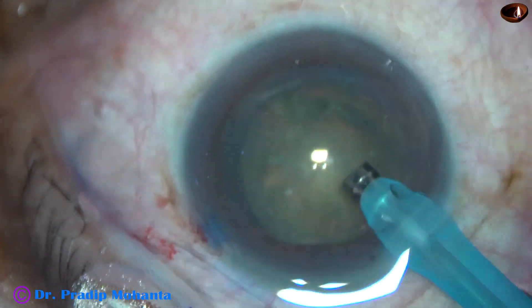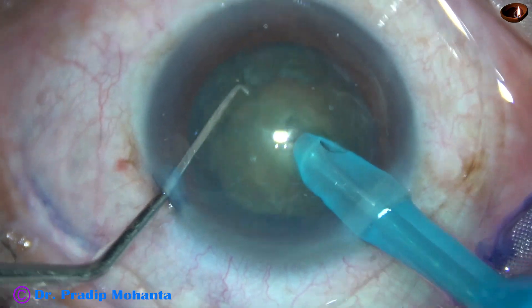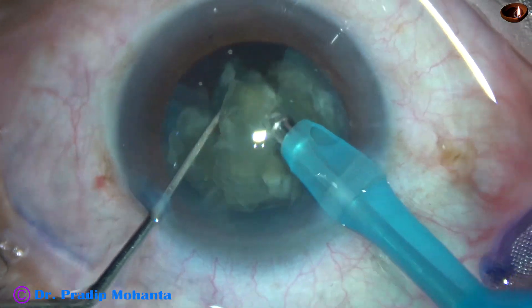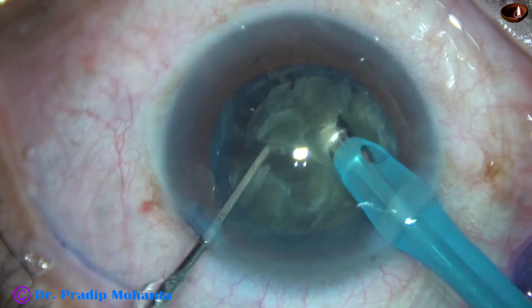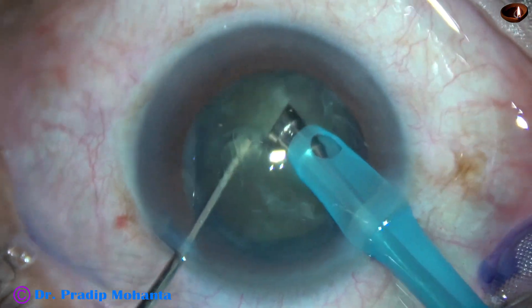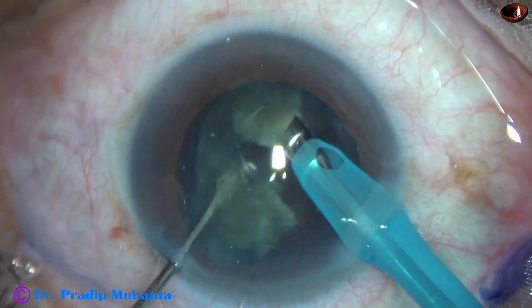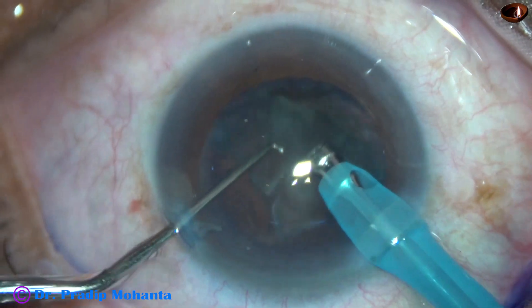After aspirating some cortical lens matter, the handpiece is turned to make the bevel up. The tip is buried deep into the substance of the nucleus and it is chopped. In such cases where the nuclear sclerosis is grade 3, we need not go to the periphery — we can just hold the central part of the nucleus and chop. The other hemi nucleus is chopped into fragments. Each nuclear fragment is emulsified with ultrasonic energy, which is 65% in this case, and then it is aspirated.